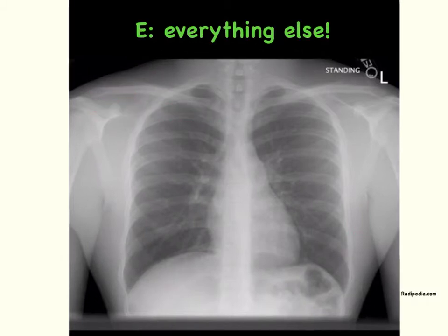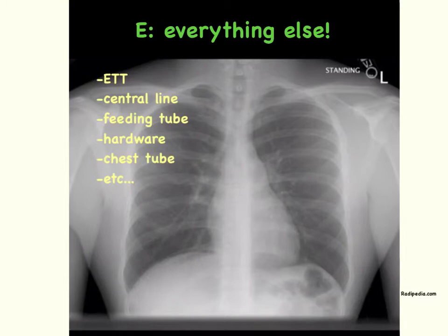E is a broad category that covers everything else in the chest x-ray not covered in the ABCD part. Although you may only be getting a chest x-ray to evaluate the lung field or the cardiac size, you have to evaluate every part of the film because you're responsible for anything seen on it. This everything else category includes evaluating the position of ET tubes, central lines, feeding tubes, the presence of any surgical hardware, chest tubes, pacemakers, and so on.